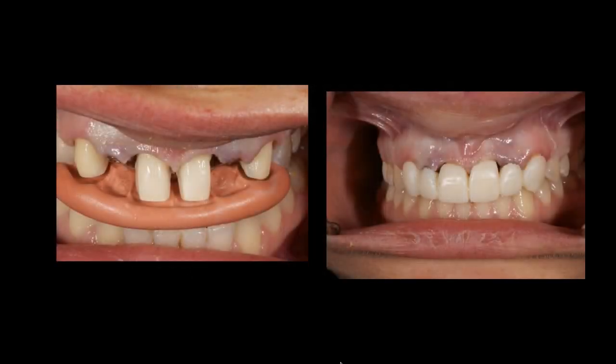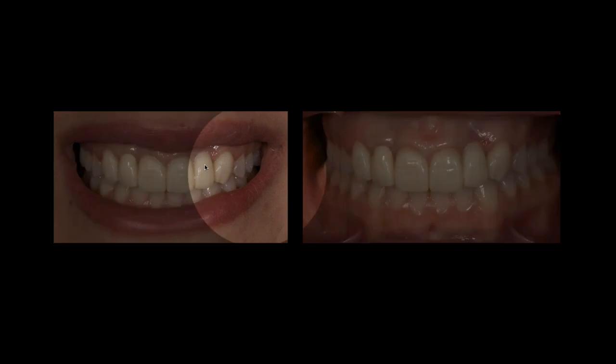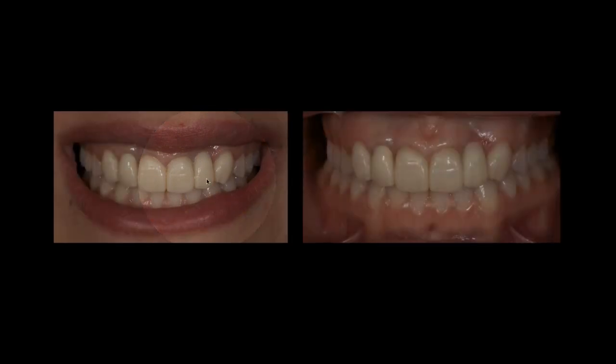So these 2 implants are placed and we're gonna start restoring them now. And what you should notice right away is that she's provisionalized, but look at the tissue around the 2 implants. Matter of fact, I would argue this is worse looking than my Maryland bridge. My Maryland bridge actually looked decent of where the tissue was and where we wanted it to be. So that's a concern now. And this patient's waited 4 or 5 years for their implants and their processes, and we're not making them better.